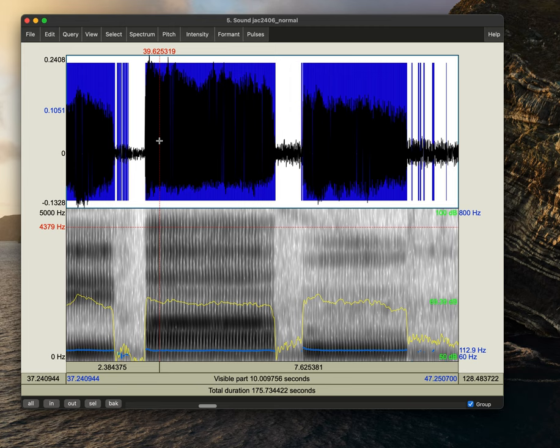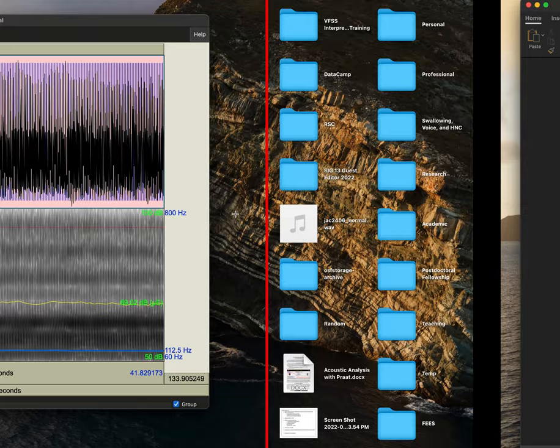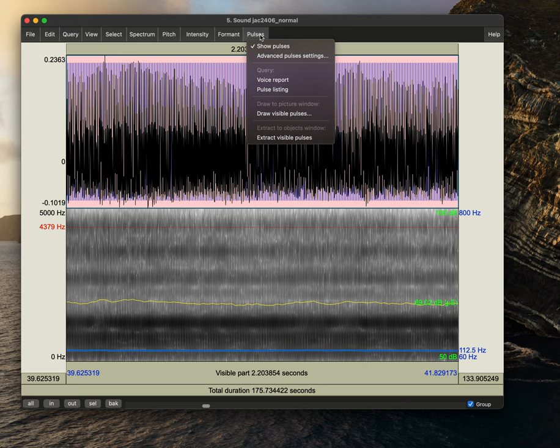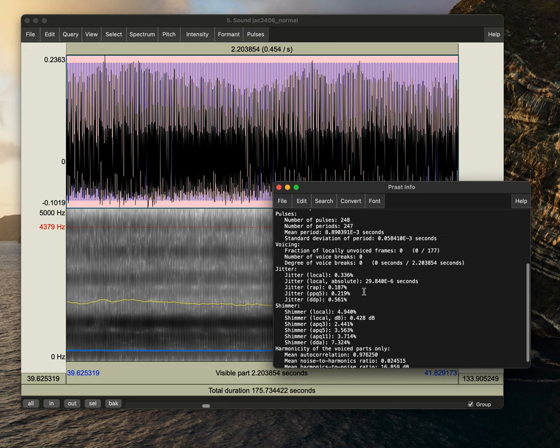Perfect. All right, so we can see that I had it at about 1.7 seconds. We'll do just a little bit more to get in our two to three second range while avoiding the offset or the onset and the offset of this. We'll go ahead and select ah, select here. And the first thing we'll do is go to pulses, voice report.